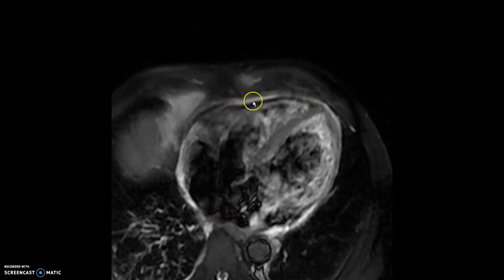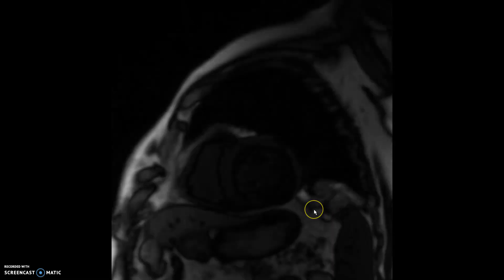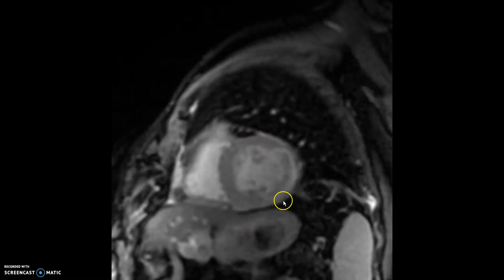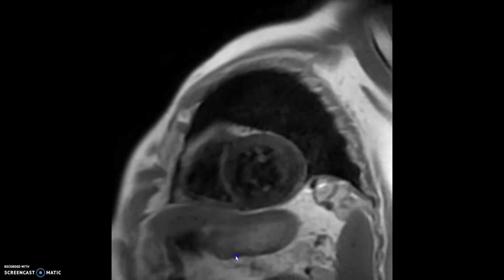Now, this could be fluid or it could be just edema of the pericardium — you cannot be 100% sure when you're looking at it. This is pre-contrast T1 map, and the T1 values were elevated; they were above 1,200 milliseconds here.